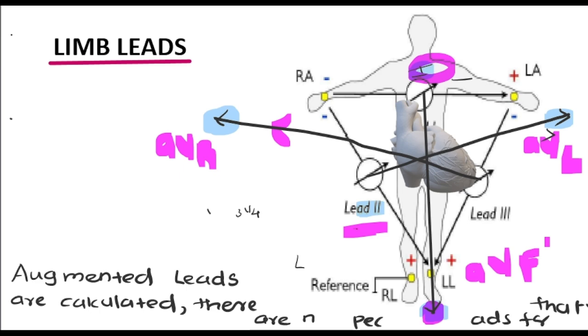So we have covered all leads. Now about the direction of AVR, AVL, and AVF, where exactly it's facing. Just memorize this picture just for a few seconds. Where AVR is going, where AVL is going. Most importantly, where AVF is going.